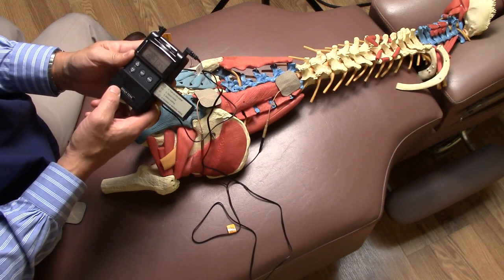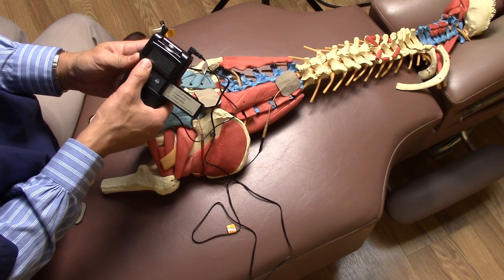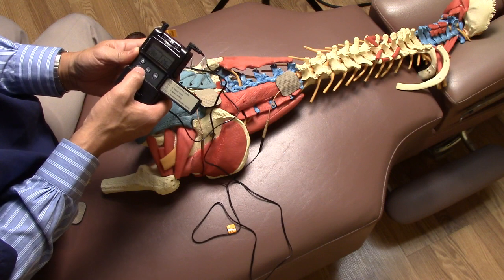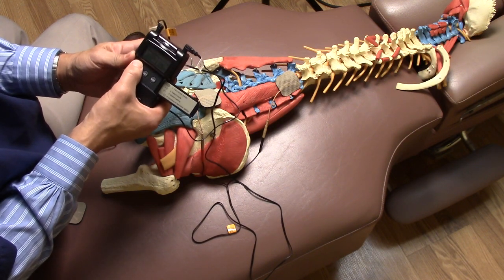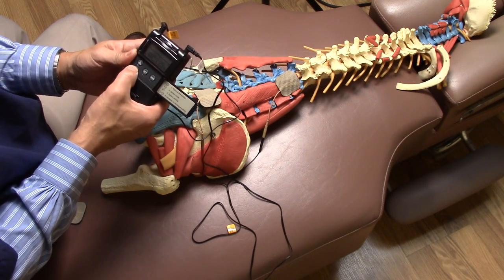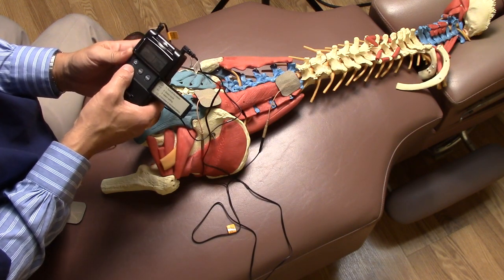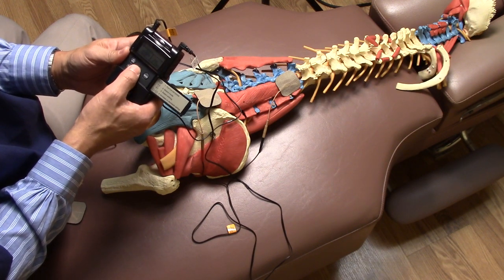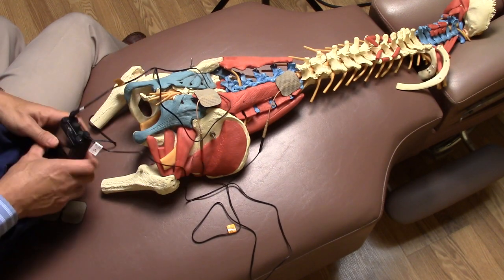If you want to make changes to the settings, press Set. The number that blinks you can make higher or lower — this is the pulse width. Press it again and you get the frequency: 100 hertz, 102 hertz; you can increase or decrease it. Press it again and you can change the treatment time — it works like a countdown timer. If you put 25 minutes, it'll turn off automatically after 25 minutes. Press Set again, press Mode, and just relax.